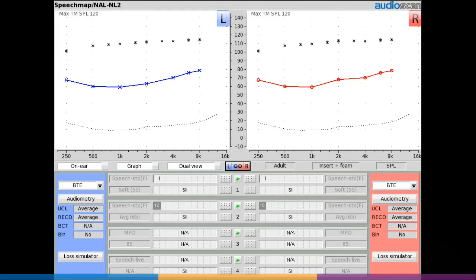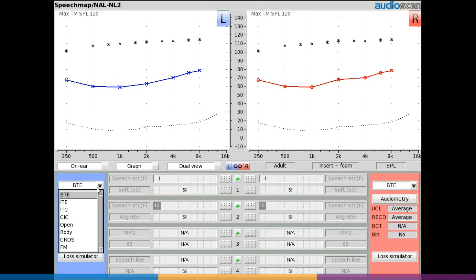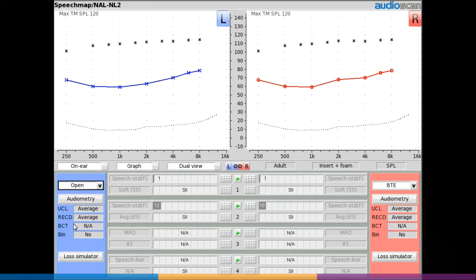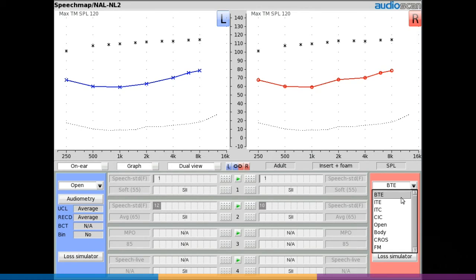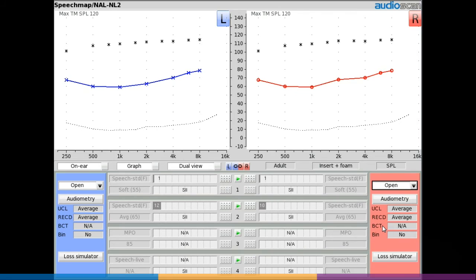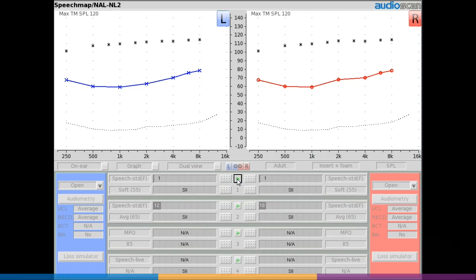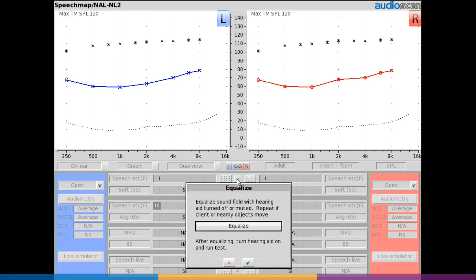The speech map protocol for open canal fittings is slightly different. When the open instrument type is selected, the sound field equalization step is separated from the rest of the test protocol to ensure that no vented amplified sound enters the reference microphone. When the first open speech map test is initiated, the user is prompted to mute the hearing instrument and select the equalize button to level the sound field.